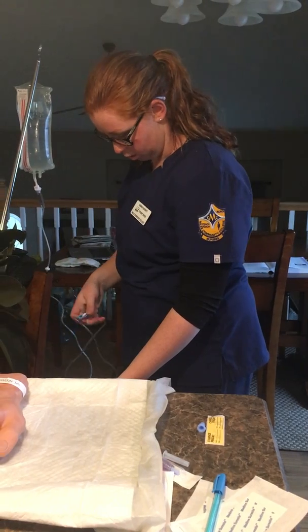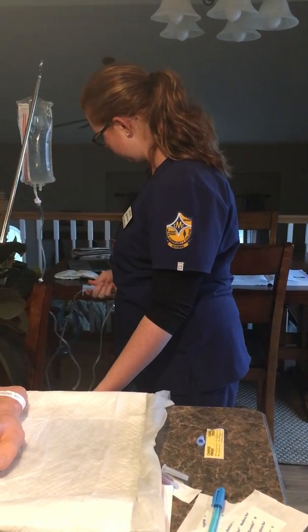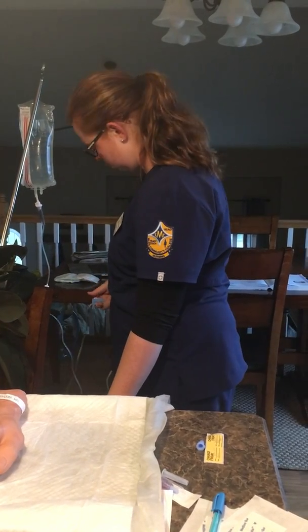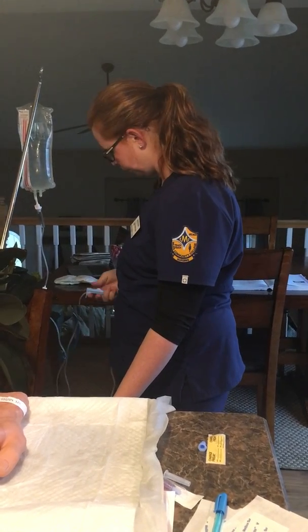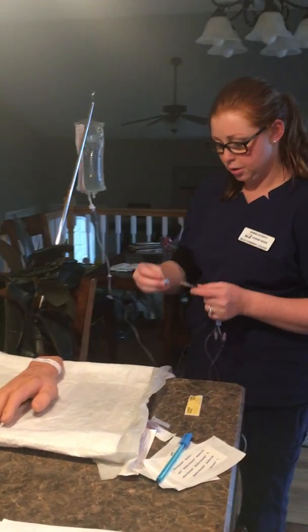Prime my tubing, get all the air out. There we go.